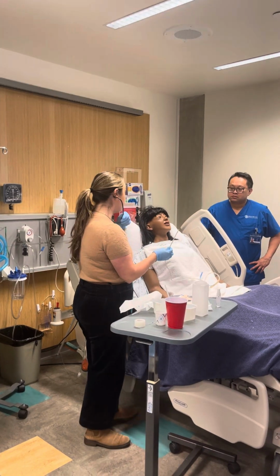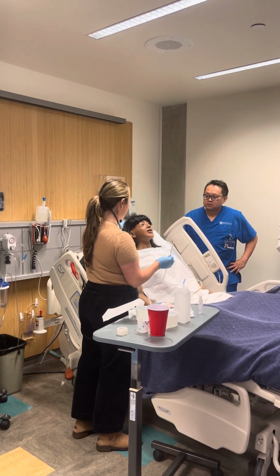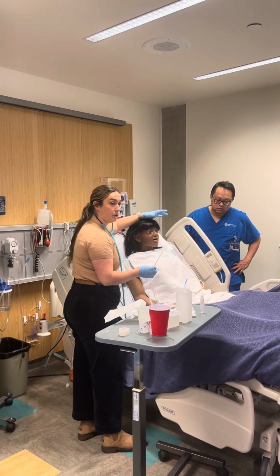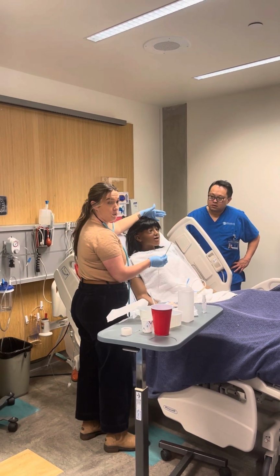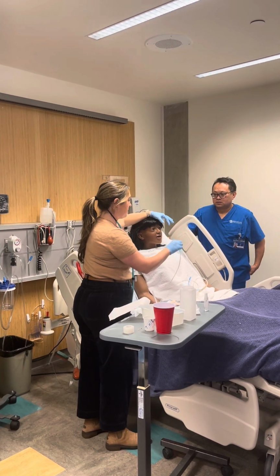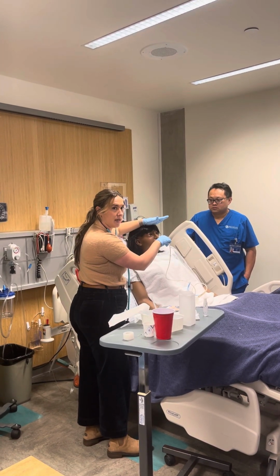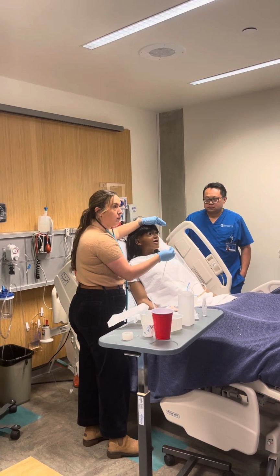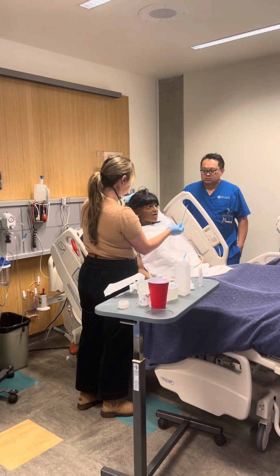And then I'm going to say, okay, Tran, we're going to start putting in the NG tube. You're going to start feeling this come through your nose. I want you to tuck your chin to your chest, and I might help them do that. I also like to have my hand right here on their forehead if this is a person who starts shaking their head because they hate what we're doing, which is much more common than you think. As I'm inserting, I can hold on to this and have a stable point on their forehead, not poking them in the eye, and making sure that this isn't coming out as they're shaking their head, because what have they suffered for if my NG tube is just about to come out anyway.